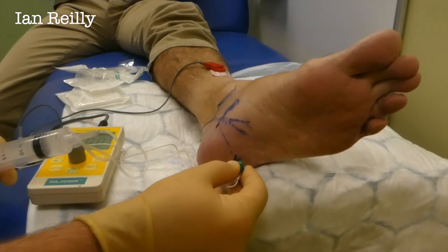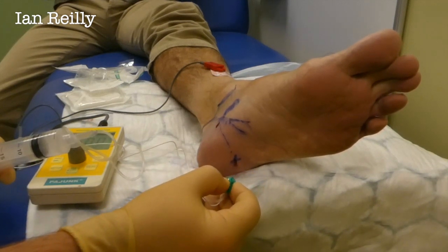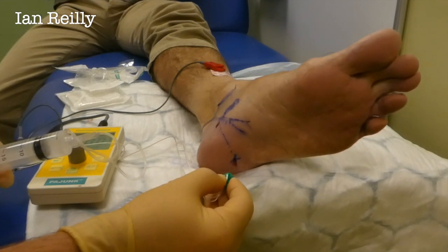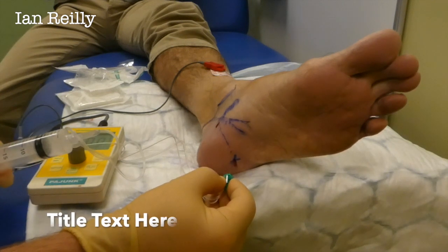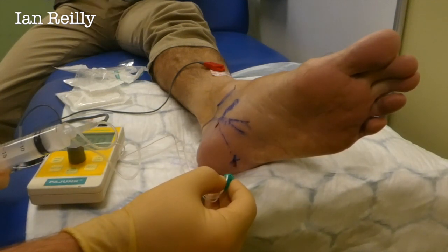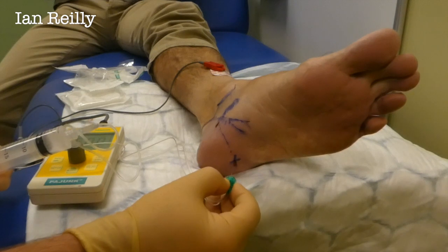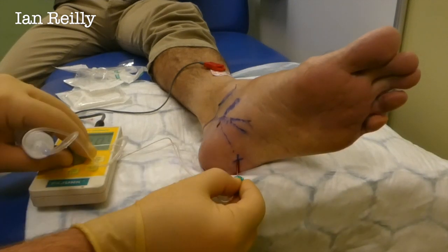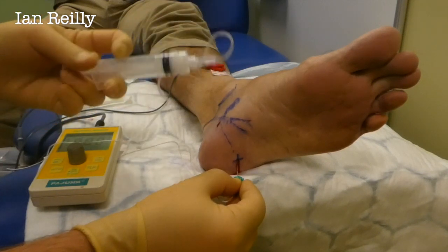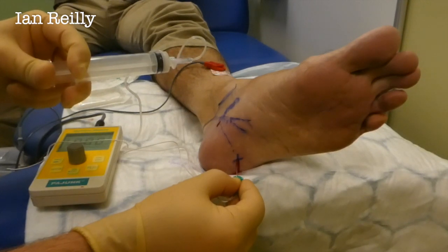It's a little bit uncomfortable there. Having said that, if you've had cryo here, there's probably a patch of numbness — not from the middle side, but from the outside, from where we had the first injection, probably from where we went in the first time. We aspirate, then inject — hold it there — you'll get a little bit of back pressure. Yes, I feel it.